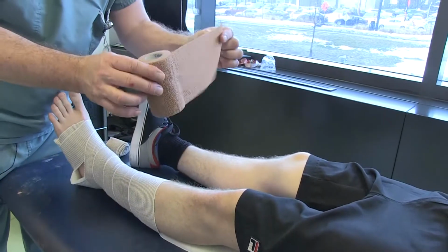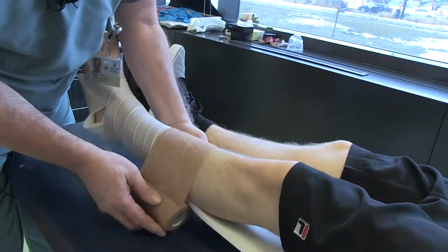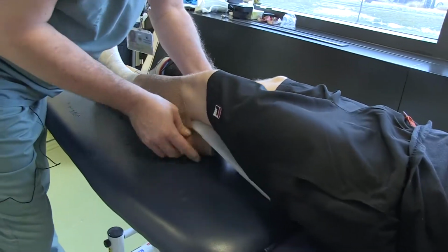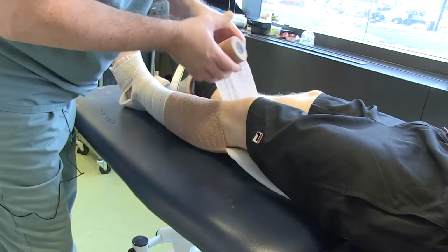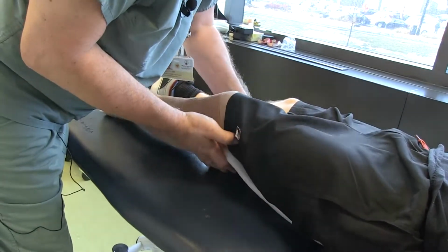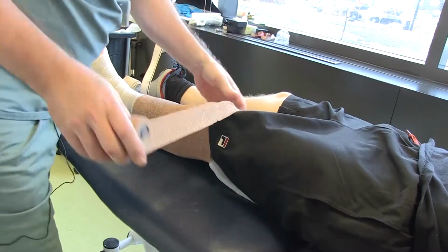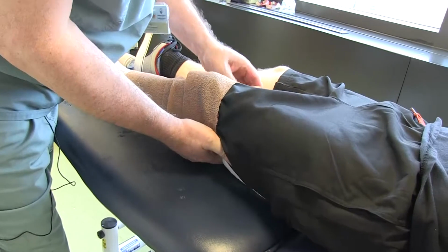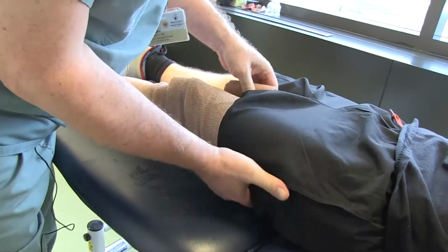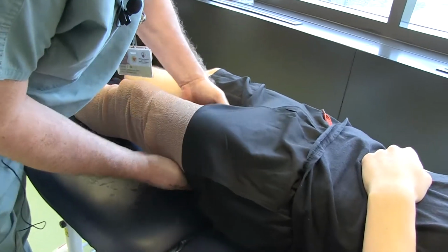If the patient is tall, you could use the cohesive and flexible bandage, which is larger, so it installs really well. You're better off unrolling it prior to applying it. To use the natural curves, like under the knees, is a good idea as well. So we unroll. We run it underneath the knee, and we could tie it after. We should be able to go at the highest possible point with our bandage. If the patient is in a lot of pain, you could stop here at the thigh, will be enough.